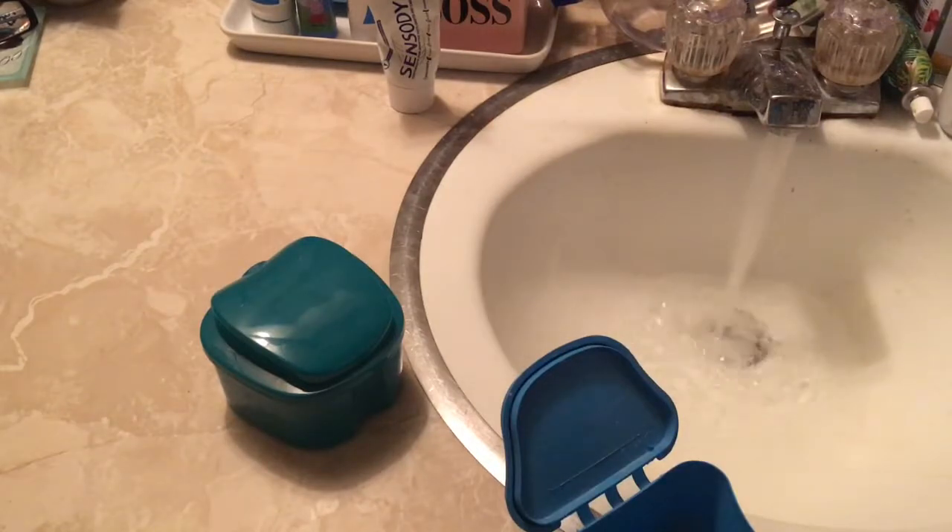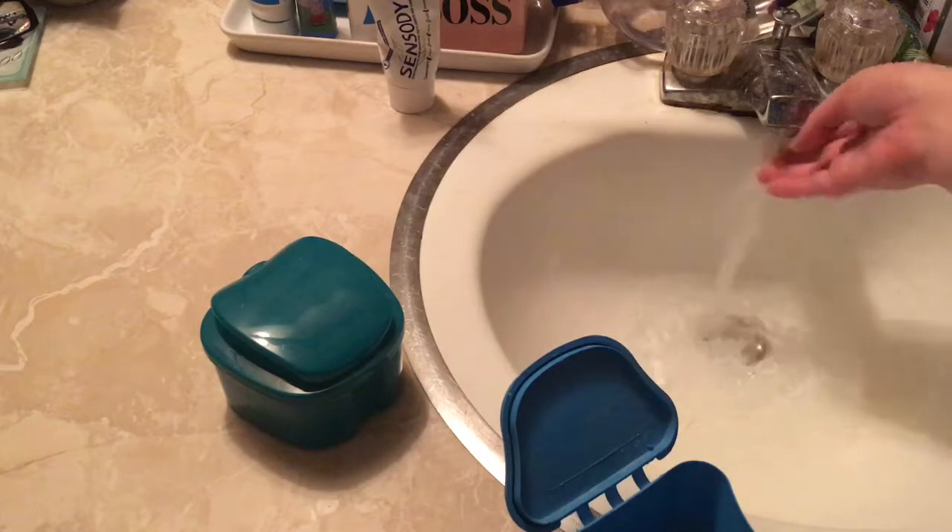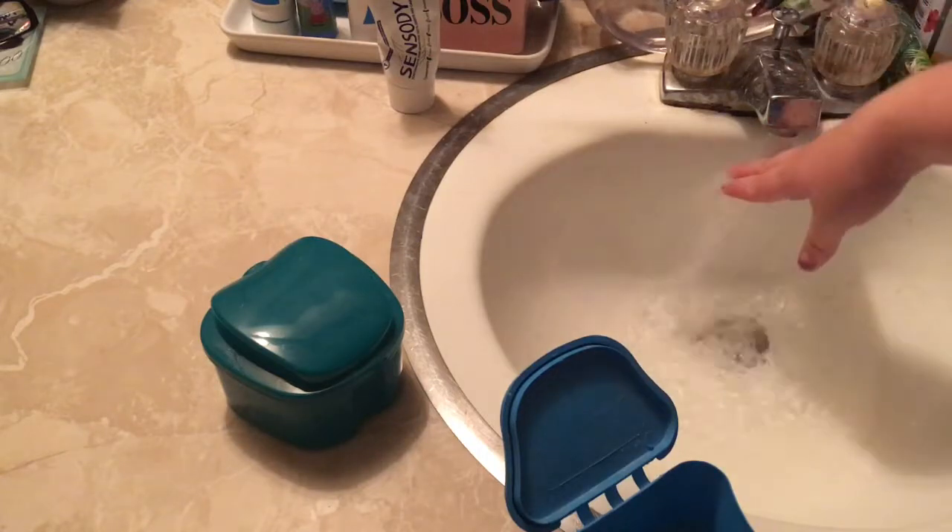I put the tablet into the denture case that I got with my flipper a few years ago. I'll open up the tablet and pop it right into the case, then add warm water. You don't want it too hot because that's not good for your flipper.